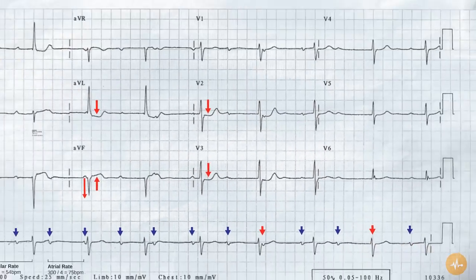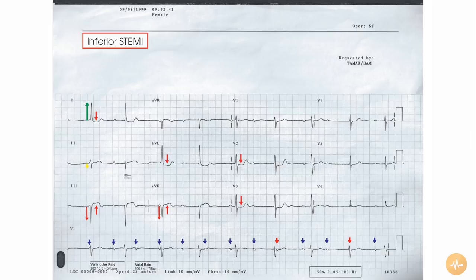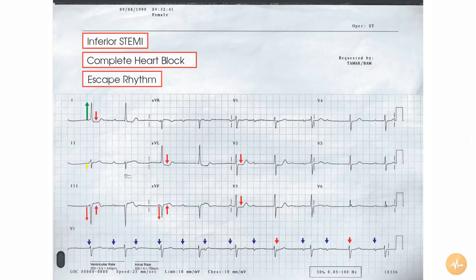In summary, this 12-lead ECG recorded from a patient with chest pain shows evidence of an inferior ST segment elevation myocardial infarction. In addition, the patient appears to be in complete heart block, with a relatively narrow complex escape rhythm, probably arising from high inner conduction pathway, i.e. the His-Purkinje system.